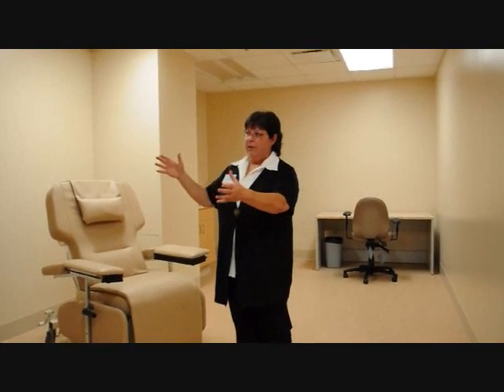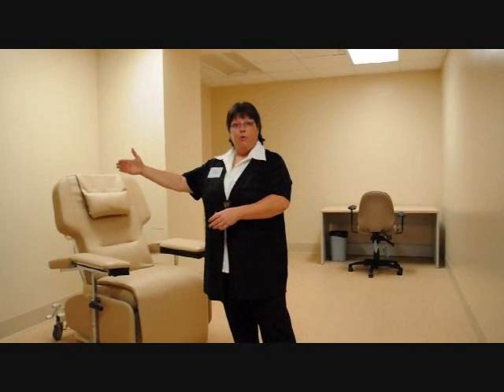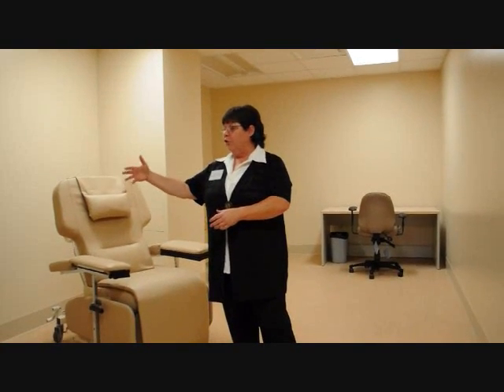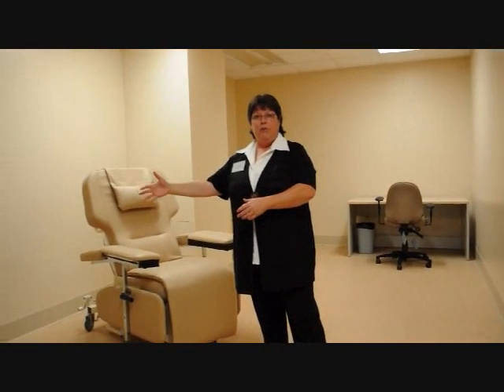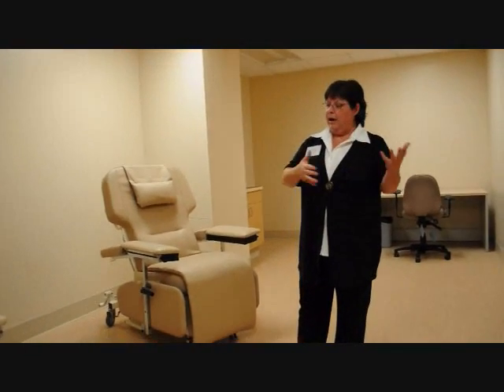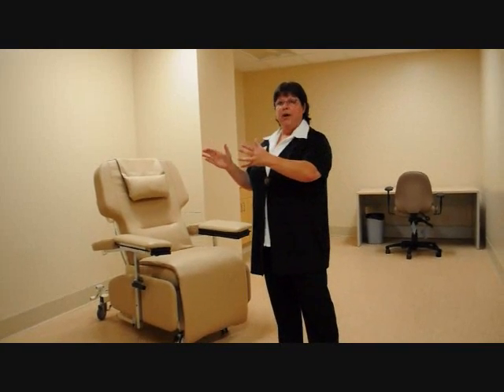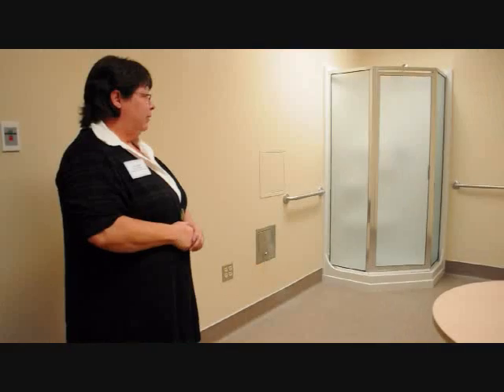The machines are not here. You'd have a home hemo machine, and you'd have a water filter rack, and the patient needs to learn how to change the filters in their racks, run the machine, do their needling, organize their supplies, the system. So it is a little more involved in the training for this.